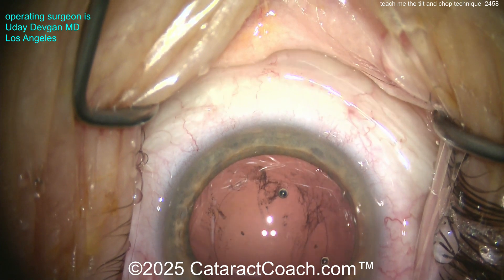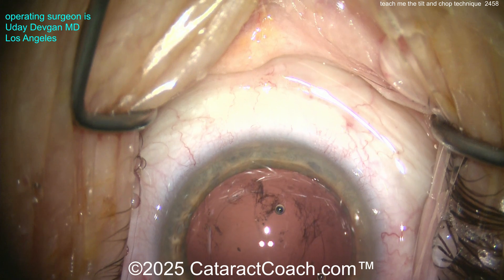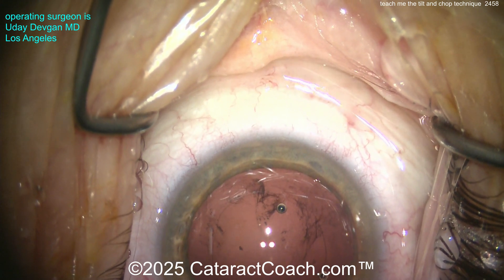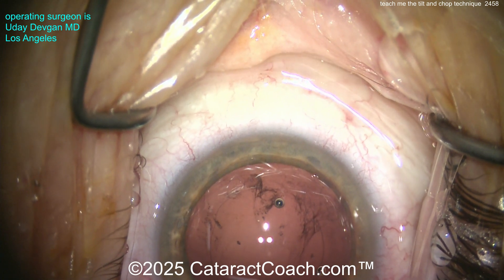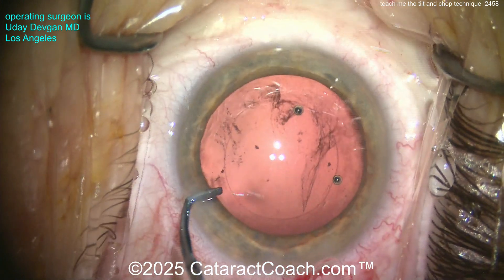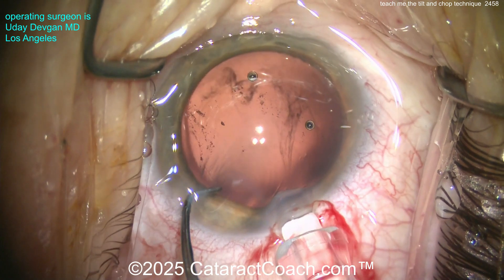I think you'll like the tilt and chop technique if you have patients who are two to three-plus nuclear sclerosis and you're able to create a consistently five to five-and-a-half millimeter rhexis. This is a great technique — very safe to the capsular bag, safe to the cornea. I promise you this patient will have a clear cornea the next day.